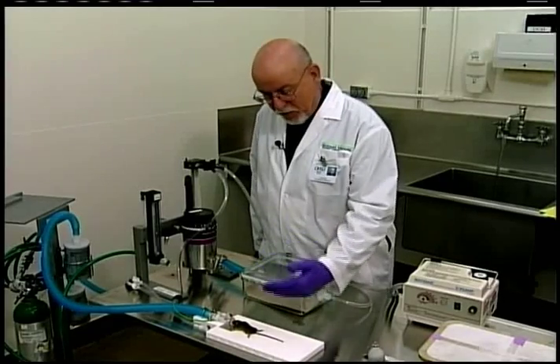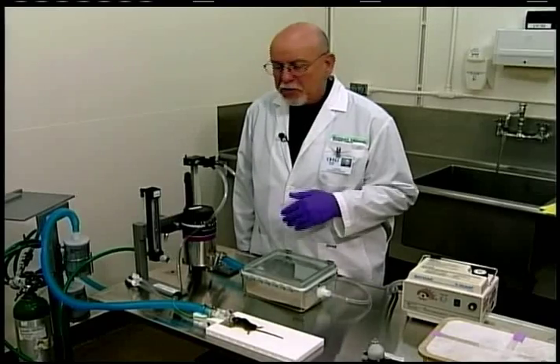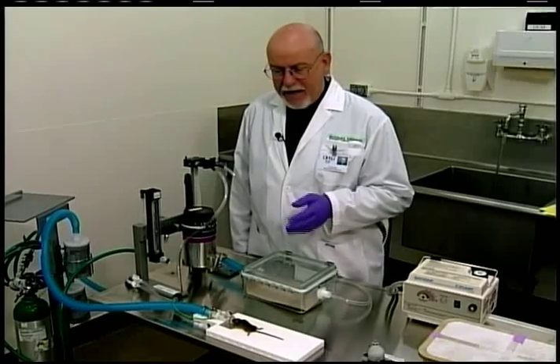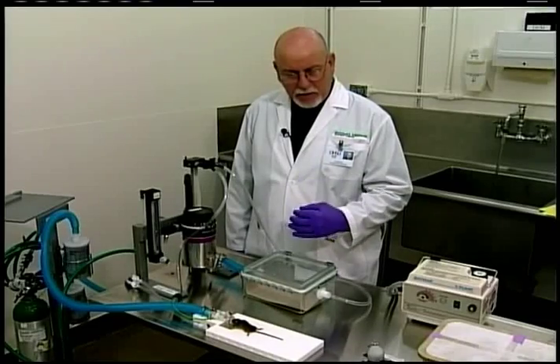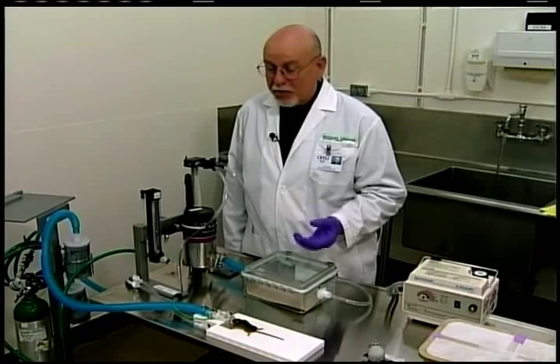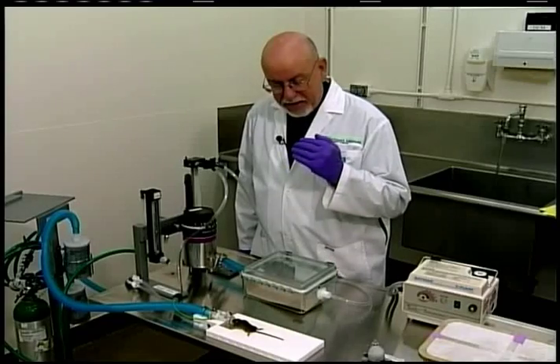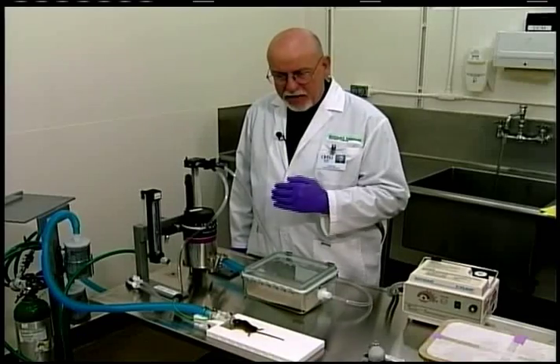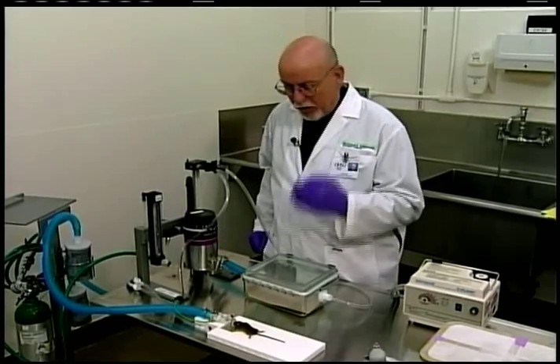Now I'd like to reverse that process and show you just how quickly these animals recover. It's absolutely remarkable to me, and I've seen animals that have been anesthetized for hours. And we take them off the non-rebreathing system, put them into a recovery chamber or the induction chamber that we used on 100% oxygen, and they recover within 2 minutes, and it's the darndest thing I've ever seen. It's so remarkable and makes the recovery process so much more efficient. The investigator doesn't have to sit there for hours while they're waking from injectables. It's just a great, great process.